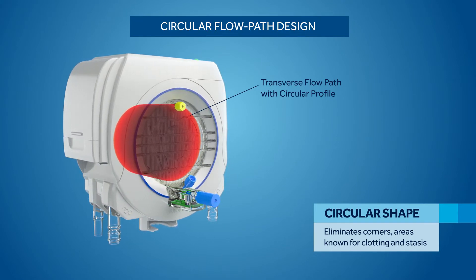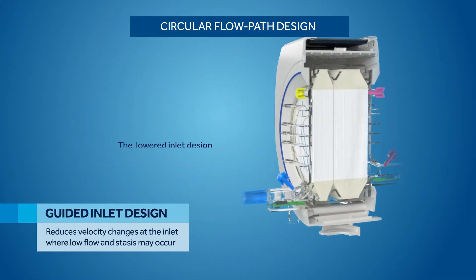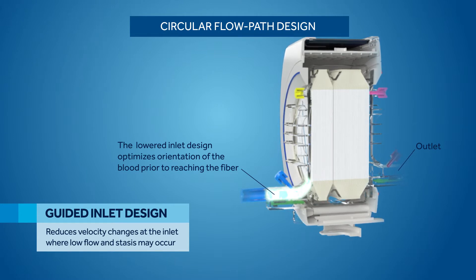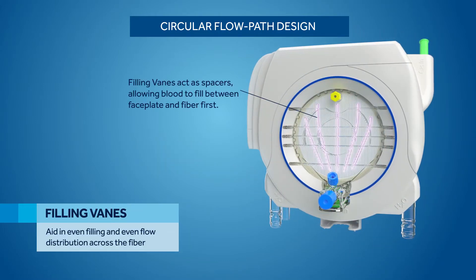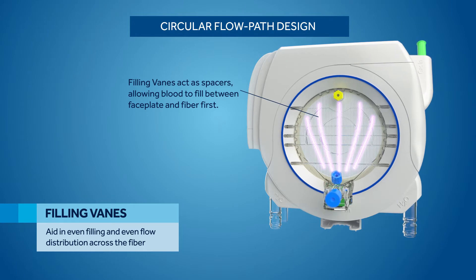The circular shape eliminates corners, areas known for clotting and stasis. The guided inlet design reduces velocity changes at the inlet, where low flow and stasis may also occur. Finally, the filling vanes aid in even filling and even flow distribution across the fiber.